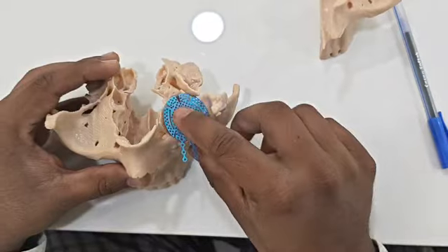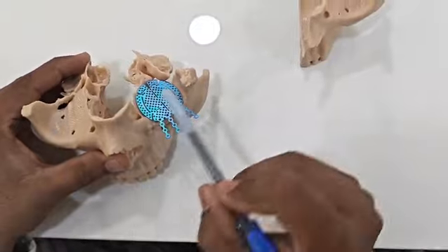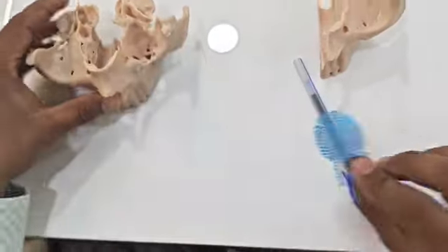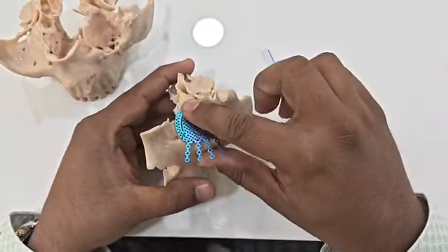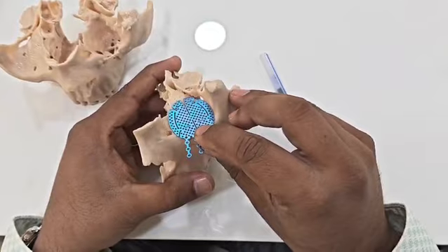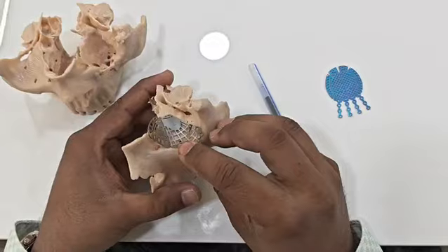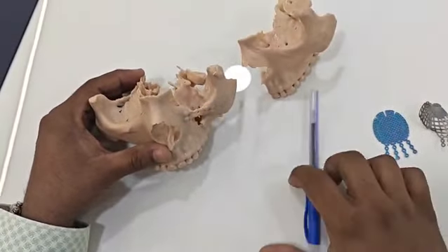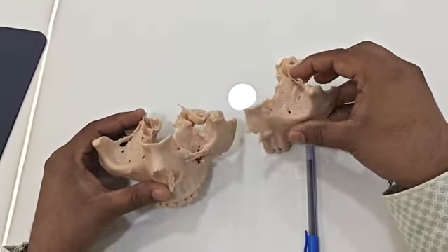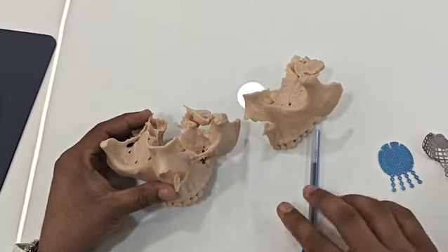So we will be carrying both these plates, and we will make sure we try to match the floor level with the opposing side. Both of these plates are fitting well with the mirror imaged model as well. If you see, it is nicely taking a shape, and this particular plate is also taking a good shape on the reconstructed model. This is the advantage we are getting with 3D printed technology and pre-planning. This definitely reduces the operating time, and the challenges we are expecting during operating time, we already know.